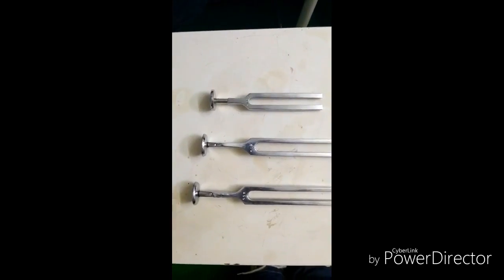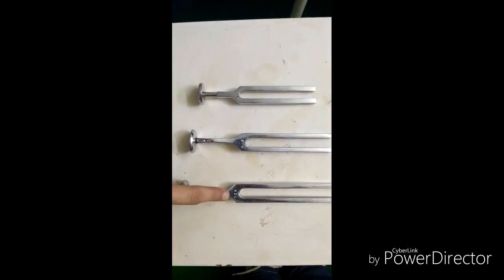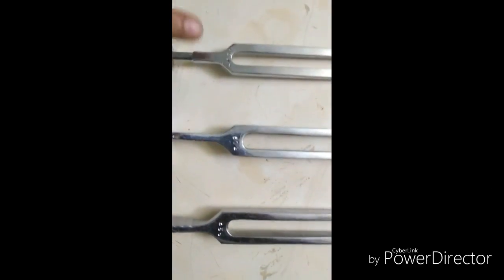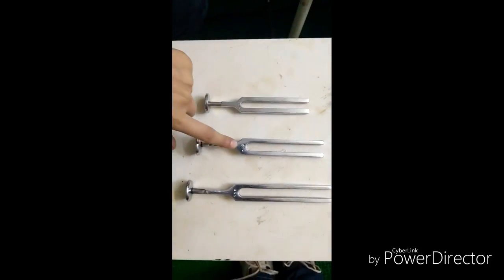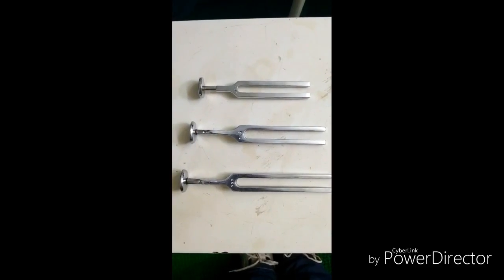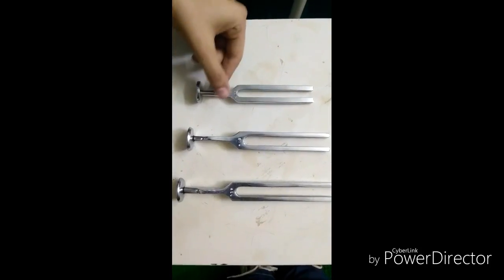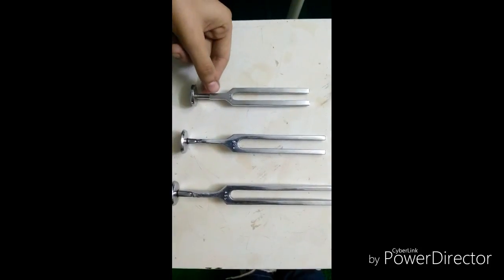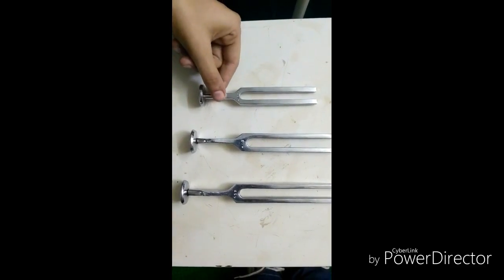Here are the three tuning forks. The frequencies are written on the shoulder of the tuning fork: 256 Hz, 512 Hz, and 1024 Hz. The most commonly used is 512 Hz in ENT practice. The parts of the tuning fork are the base, stem, shoulder, and prongs. The tuning fork is held from the stem part so that it is easy to use.